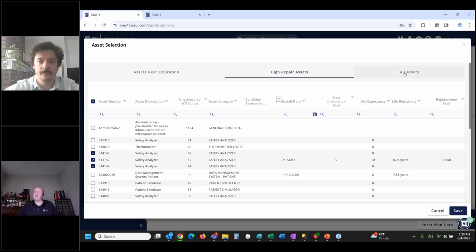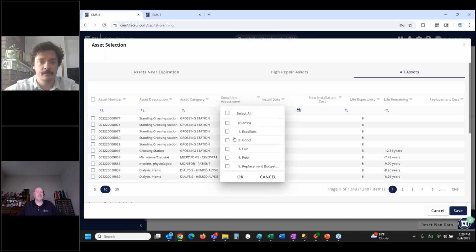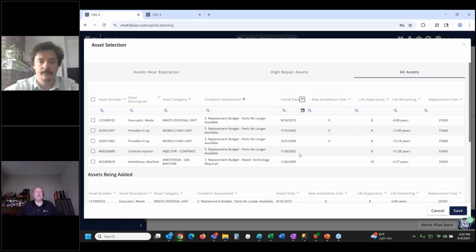So if you did increase the frequency of a piece of equipment, that's something else we could look at as well. And finally, we just have the section called all assets. If we want to just filter by this, those were the ones due for replacement, but maybe we have some newer equipment that's set for replacement budget as well. We could select those. We could select everything, maybe some of the older equipment. We have some stuff going back to 2002, 3, and 4. Those are the ones we want to replace. So if we wanted to go ahead and pull everything 2010 and prior that has a replacement budget, we can do that. So this is more of a filter on all of the assets in the CMMS, where I could filter on all those fields to kind of pull those up.